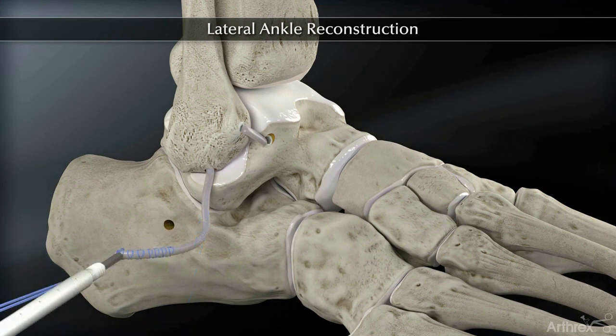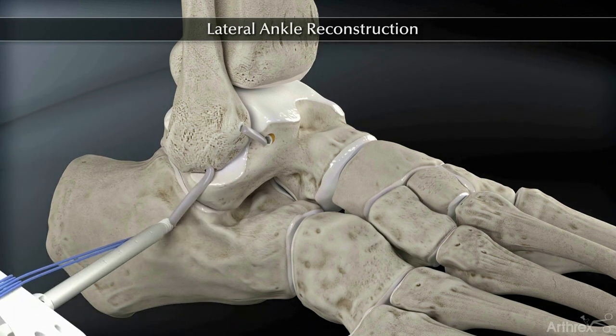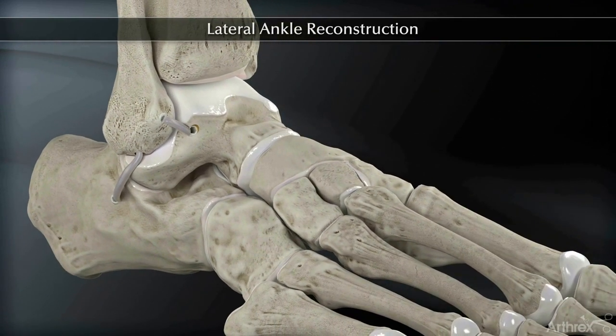Load the free end of the graft onto the 6.25 mm biocomposite tenodesis screw and insert the tendon and screw into the calcaneal tunnel and advance the screw until it is fully seated into the bone socket. This completes the repair.